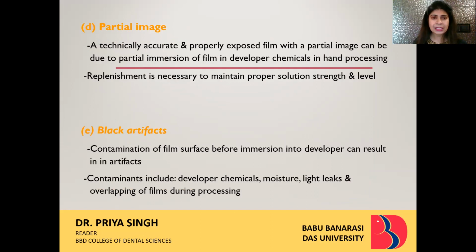Partial image. A technically accurate and properly exposed film with a partial image can be of no use. It happens usually when the processing solution has gone too low in the tank. It happens when the solution is not up to the mark. So as I told you, it should always be replenished depending upon the daily, weekly, or monthly usage in that particular darkroom. Black artifacts: contamination of film surface before immersion into developer can result in artifacts.